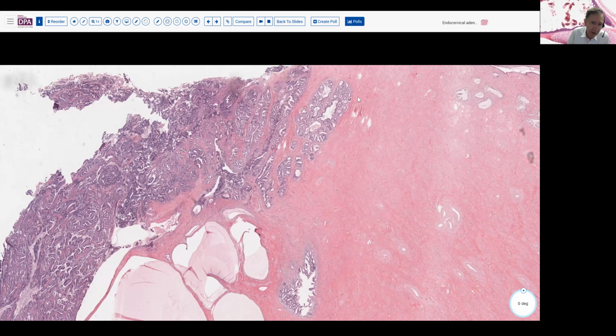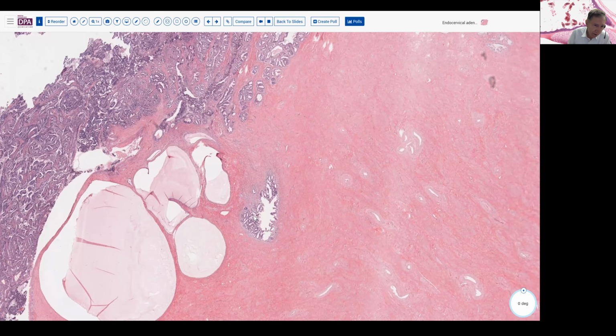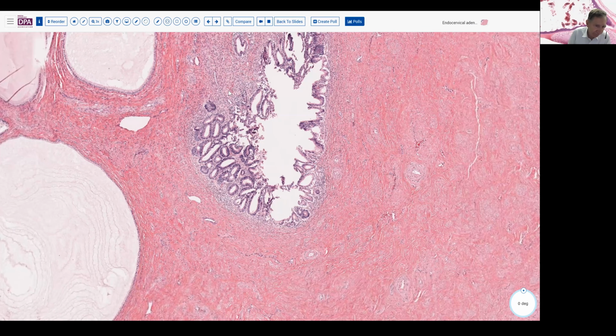And here we have a slightly nodular area that's at about the same level as these endocervical glands. This nest of abnormal tissue is slightly deeper but still has a somewhat nodular appearance with some surrounding inflammatory changes.